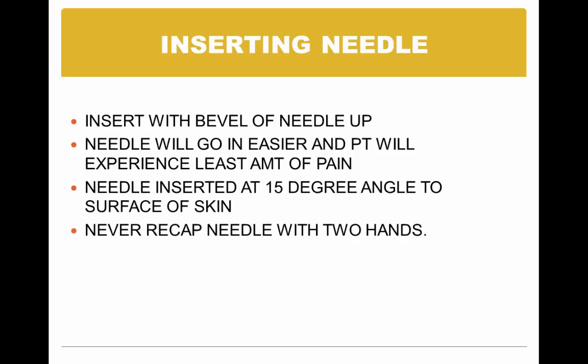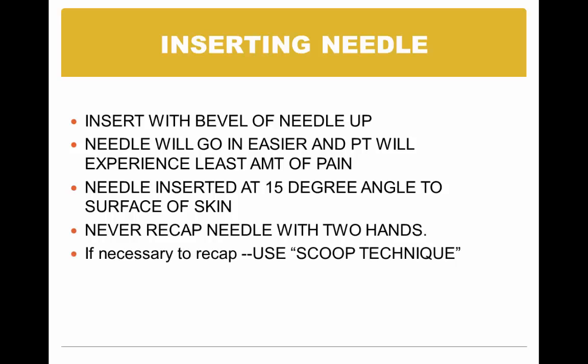Inserting the needle into someone's vein, you want to insert with the bevel of the needle up. The needle will go in easier and the patient will experience less pain. The needle is to be inserted at a 15-degree angle to the surface of the skin. And you never, never, never, never, never recap a needle with two hands. If you have to recap, you'll use the scoop technique, which we will show you in class.